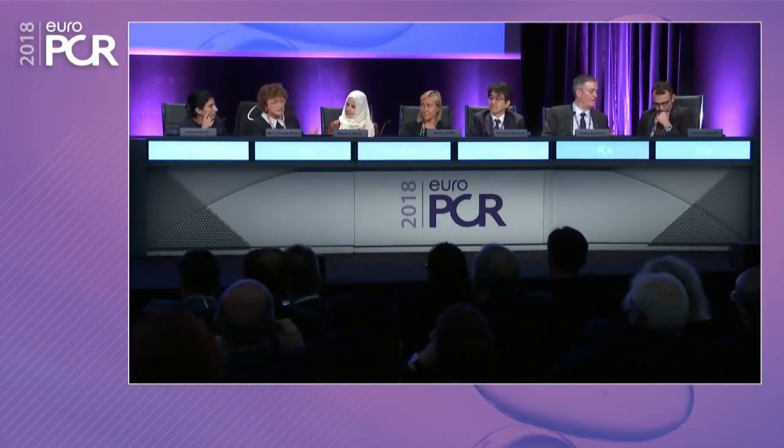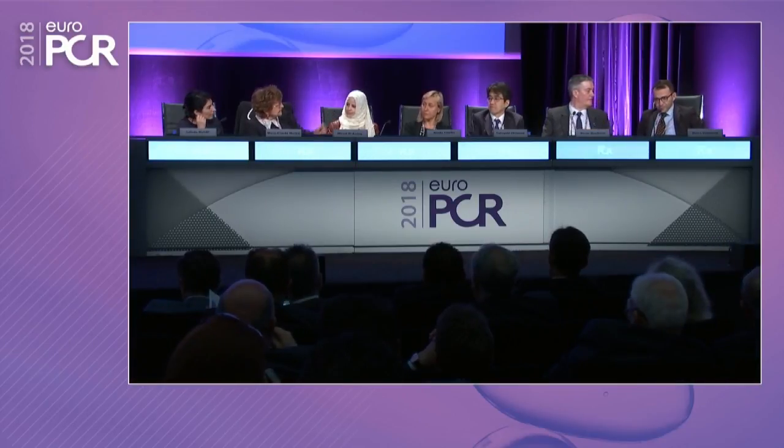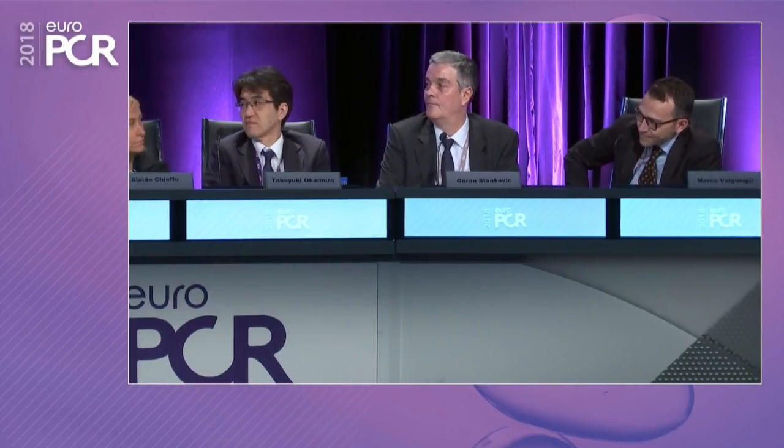Okay, so let's say while they are going to the time to react, I see Ron and Marco discussing. So what were your opinions? Actually, I was asking Goran his opinion with respect to whether final pot is needed, yes or no, after kissing balloon, because the result looks so nice that probably you can even skip that at this stage. Yeah, it's an oval shape, and you think that they didn't go very proximally. Yeah? I'm not sure that I would go to pot, but Ron.